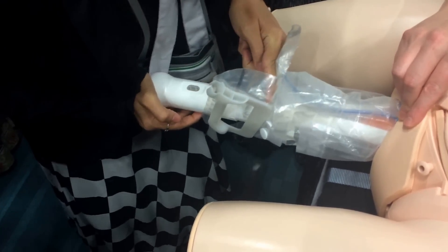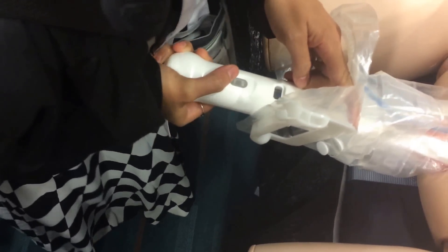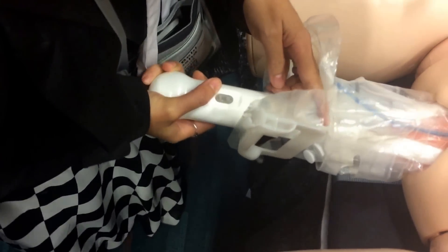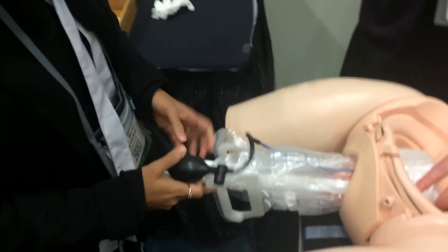Keep pushing until you see blue in that little window. A little more — good. Now pump five times.